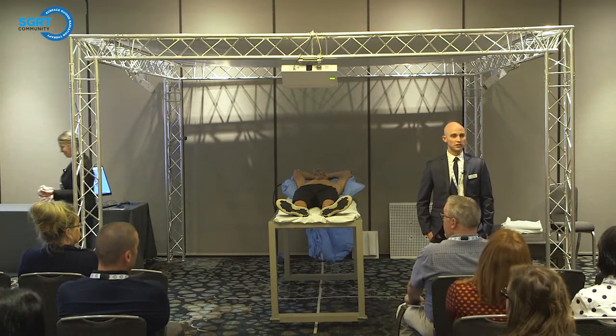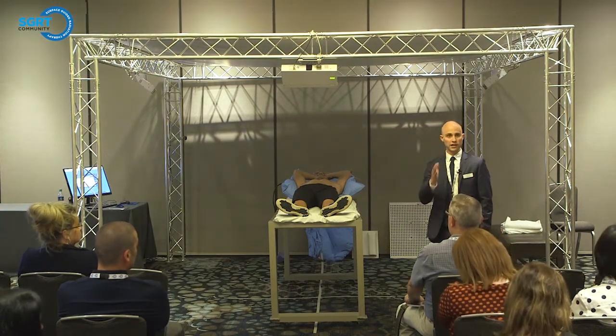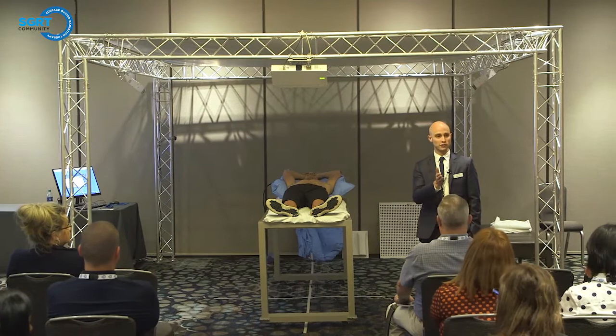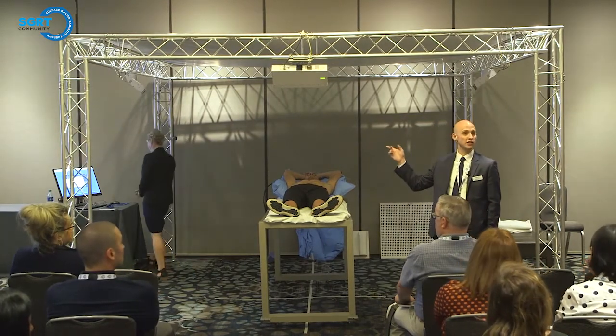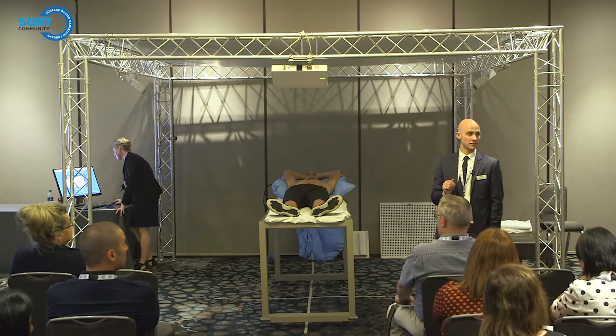That's a good question. Anytime you're lining up your patients, you want to set everything up at 0. Then once you have your couch rotations, you'll kick your couch, and then you'll click the couch rotation in the Surface software.